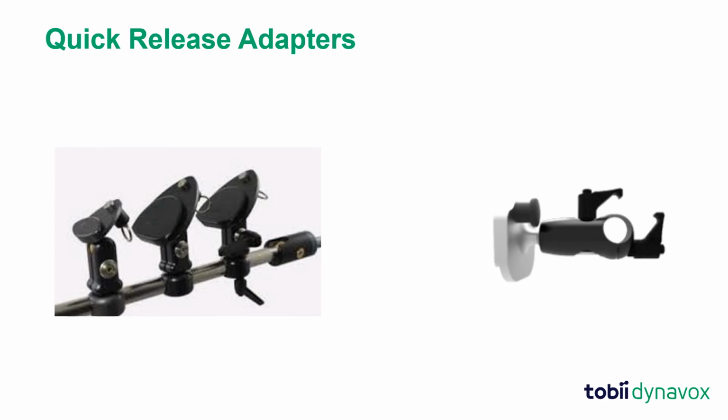Quick release adapters have 2 major features. First, the quick adjustment levers. Quick release adapters may have up to 2 levers. These levers provide greater flexibility and adjustability of the AAC device. The levers allow you to quickly loosen the adapter, to slide along the horizontal tube, or adjust the tilt or direction of the AAC device.